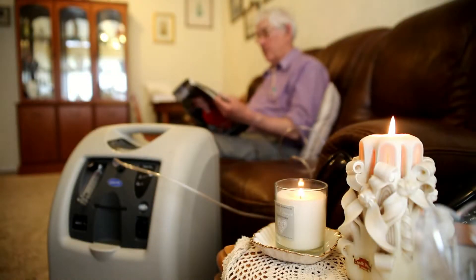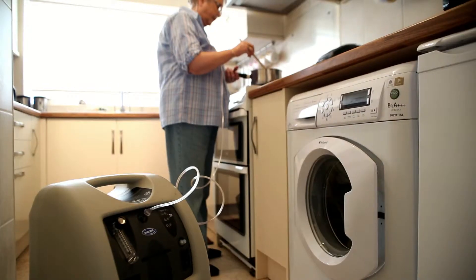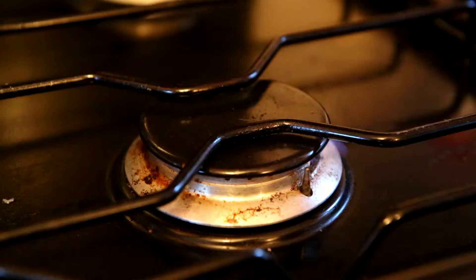The average home oxygen patient is 67 years old and has COPD. They're vulnerable and live alone. Unlike in a hospital, patients at home are unsupervised.